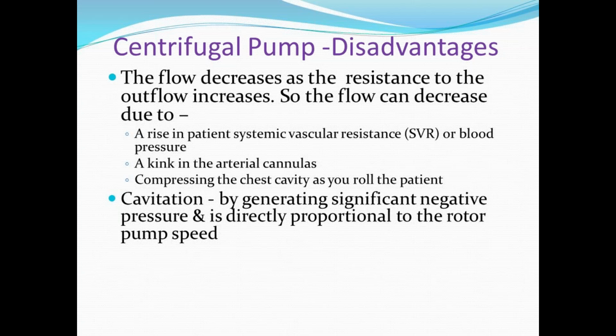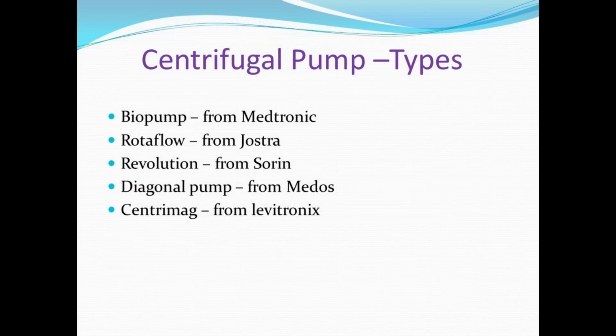There are different types of centrifugal pumps, the biopump and others. The problem is that all centrifugal pumps are machine specific, so they can fit only into that type of machine motor head. Otherwise, it does not fit. So you cannot have a Medtronic pump fit into a Magnum machine. You have to have pumps from the same company.